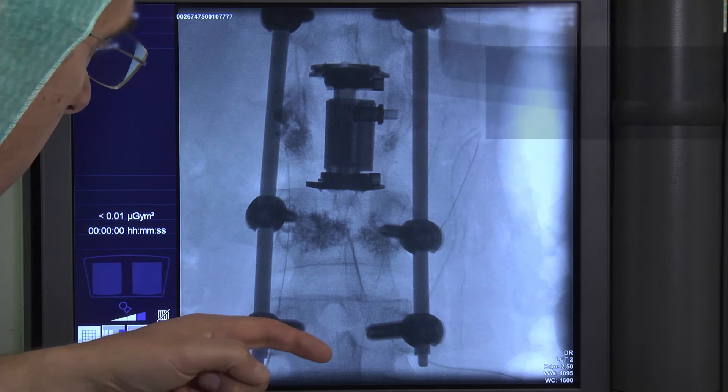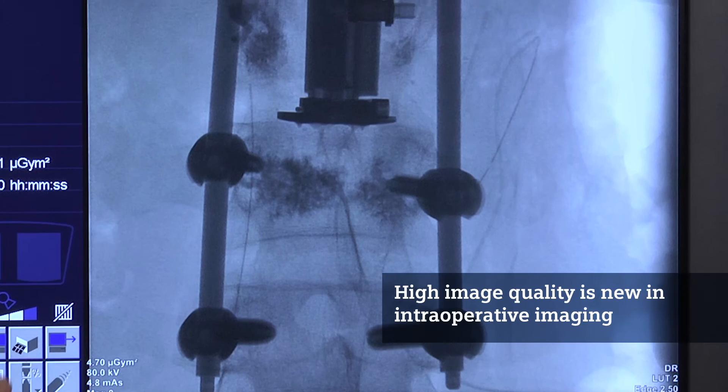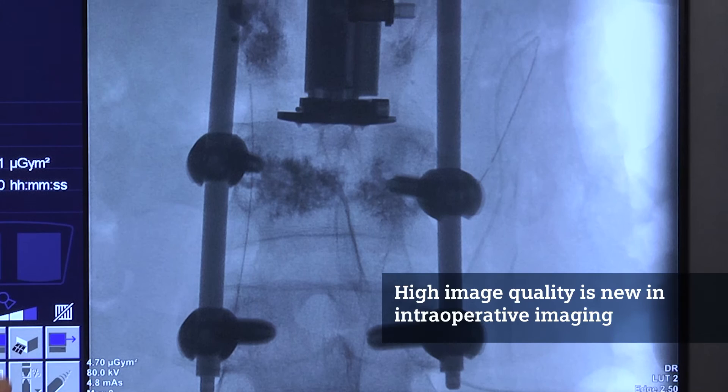You can see the alignment and the pedicle screw placement very nicely. It's tremendous how detailed the bony structures are displayed on that image — it really has the quality of a high-resolution standard X-ray. This is new in intraoperative imaging.